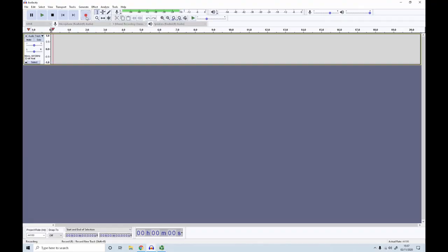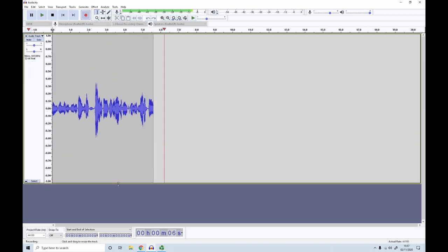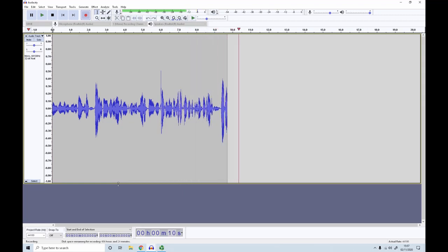Now it may well be that that was a little bit hard to hear, so what I want to show you is what that waveform looks like on a visualization program, and for that I've used Audacity, which is over here running on this screen. So here is the sound that I'm producing at the moment by talking, and if I just stop talking and put this against my chest, you'll be able to see the waveform of the heartbeat.